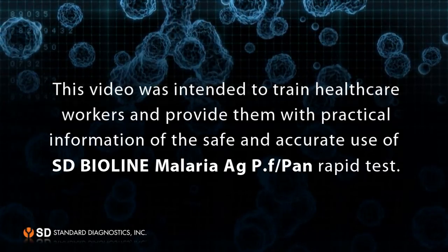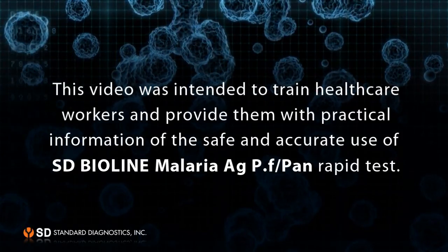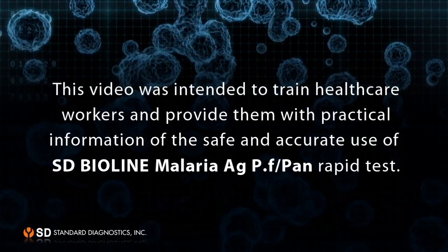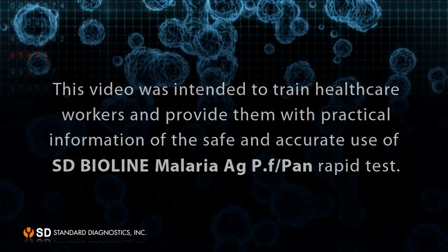This video is intended to train healthcare workers and provide them with practical information on the safe and accurate use of the BIOLINE Malaria Antigen P.f/Pan rapid test.